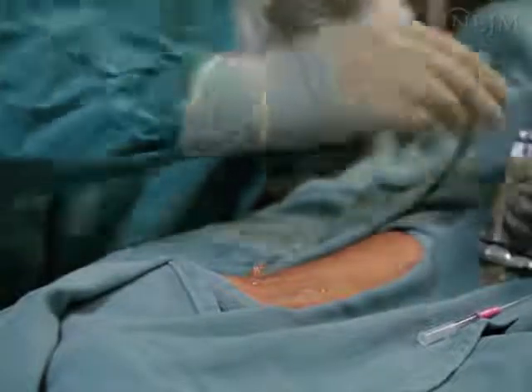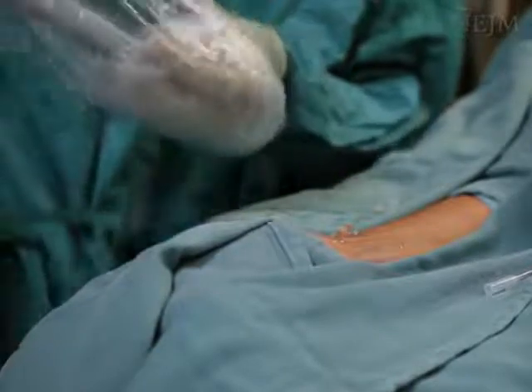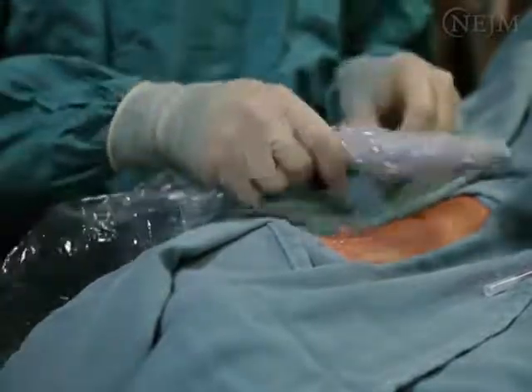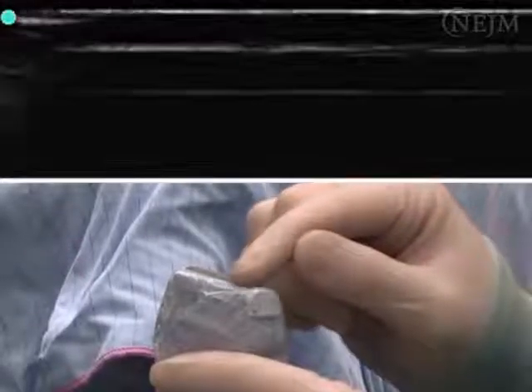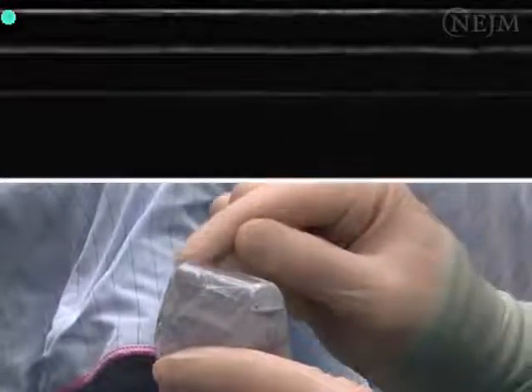Apply sterile gel to the inside of the sterile sheath and cover the ultrasound probe without contaminating the sterile gloves or the sheath. Remove any air pockets from around the probe, which if present will cause poor quality ultrasound images. Make sure that the left part of the ultrasound probe corresponds to the left side of the ultrasound screen.